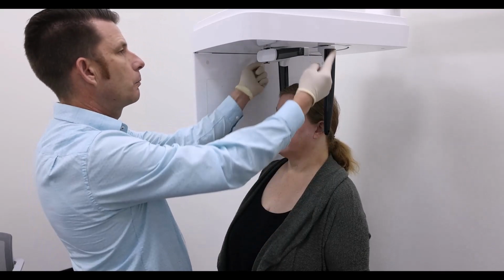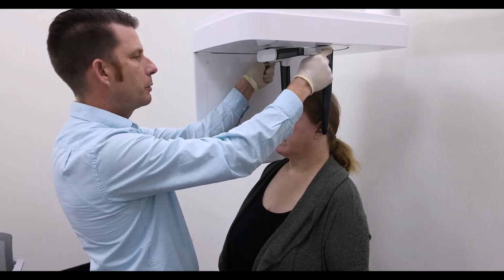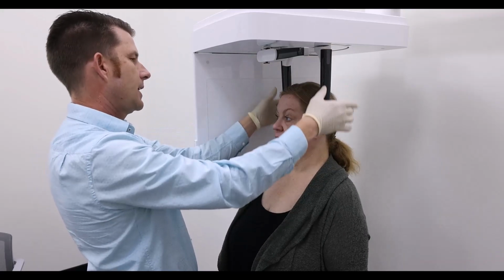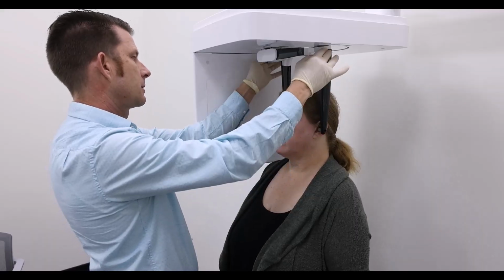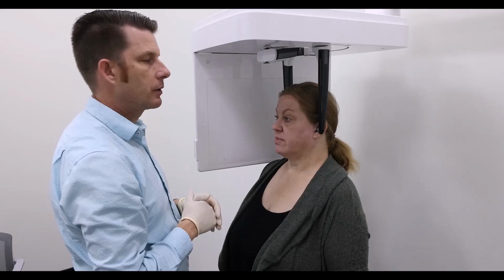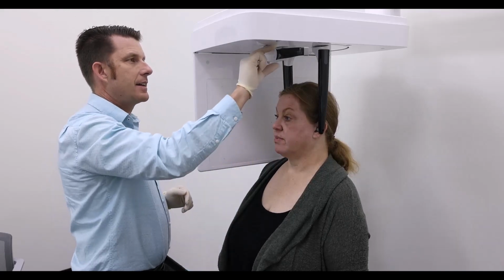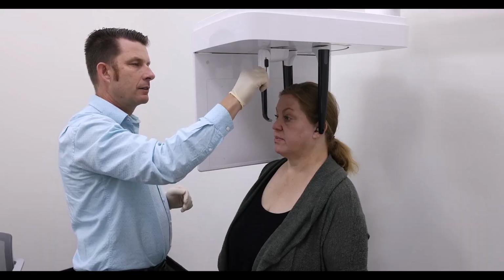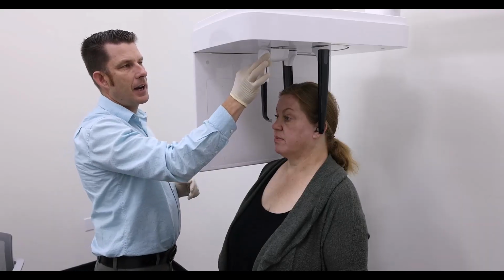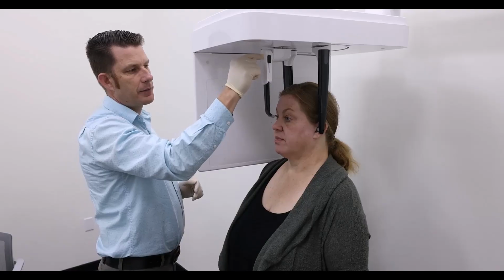And I'm going to, with my fingers at the top here, gently push on this, and you can see how these move in very easily. And I'm going to make sure that those are firm in the external auditory canals, or the ear canals. Next, I'm going to take my Nasion bar and rotate it down. You'll notice on the side I've got my pinch points here. I can move this up or down, and I want to move this forward.